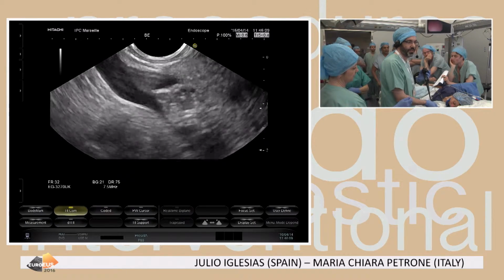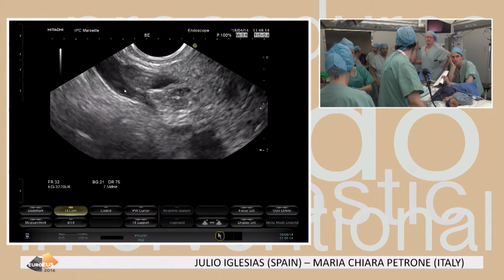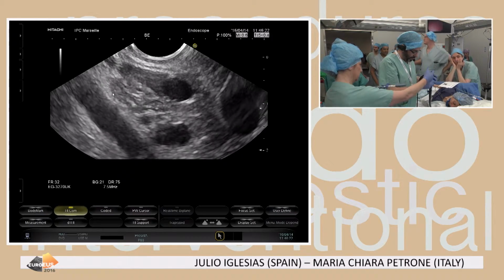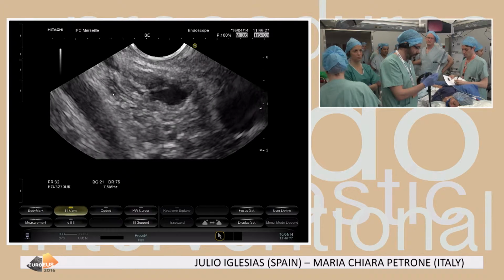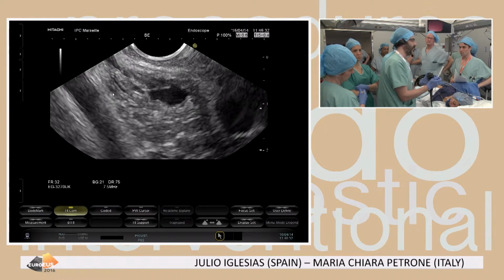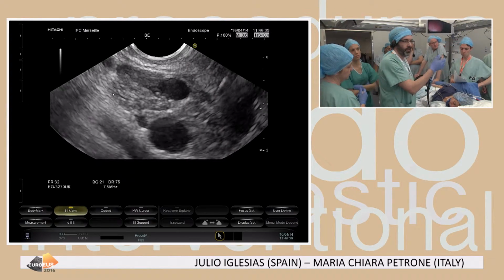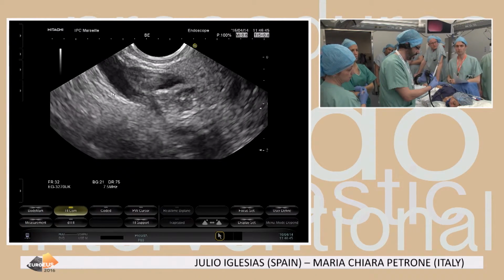So now we have here the lesion. We need to be aware that this thing that we have below is the portal vein, so it's better not to go to the portal vein. So what I always recommend in this case is if you're going to make a biopsy of a lesion and you see some nodule, please go to target the nodule. I mean, the idea of this FNA is not to obtain liquid because it's already been evaluated. It's just to target and to try to get a sample from the nodule. So we are going to use a 25-gauge needle because it's the easiest one to target these very small lesions.